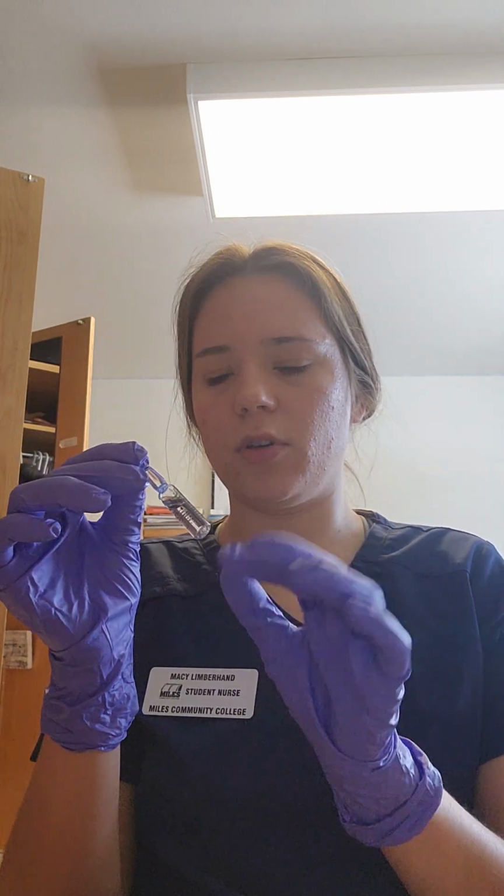Yes. So first I'm going to grab my ampule of heparin. And I'm just going to set it here. I will be looking if there's anything wrong with the ampule, if it's cracked, but nothing is wrong with it. I would look at the expiration date as well. And then I'm going to get my syringe ready before.